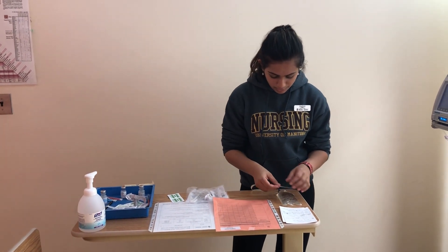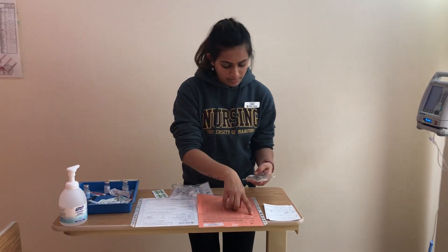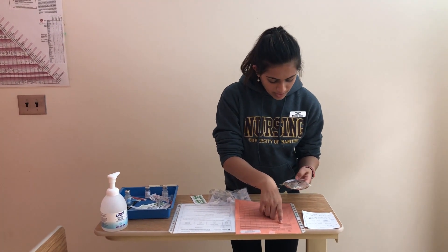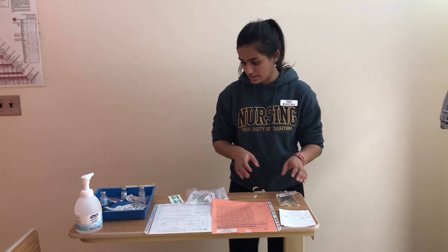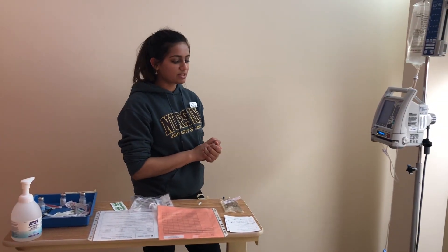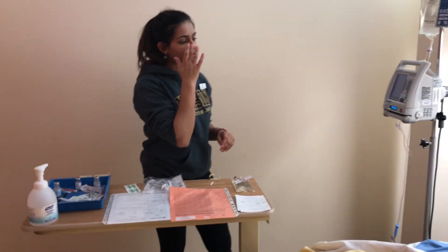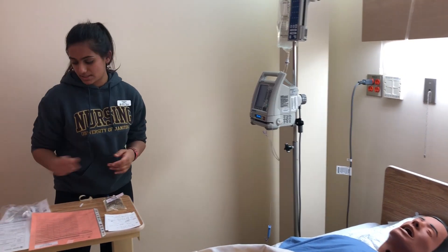I'll do my third check before administering. Putting the medication label on the mini bag: methylprednisolone, 75 milligrams — confirmed. I've already verified the right patient by checking the armband. It's for IV, which is why I have the mini bag, ordered Q6H, and the time to be administered is now. I'll inform the patient: the medication you're receiving is methylprednisolone for your acute exacerbation of asthma. Some side effects you may experience are edema — swelling — and hyperglycemia, so high blood glucose symptoms such as blurry vision or dizziness.